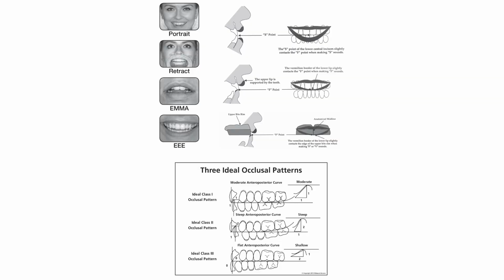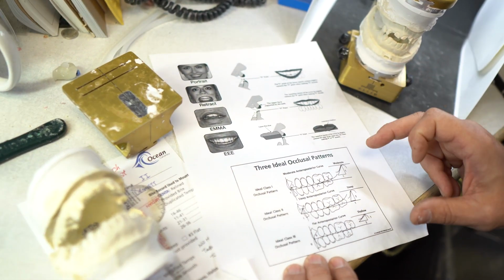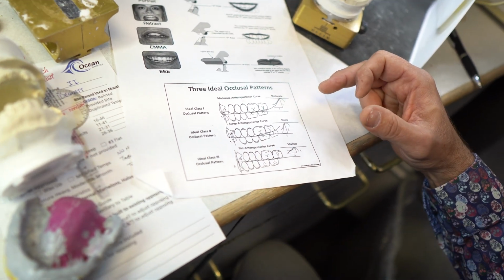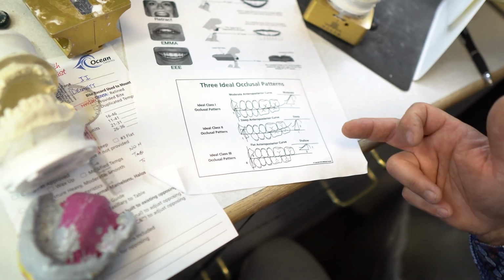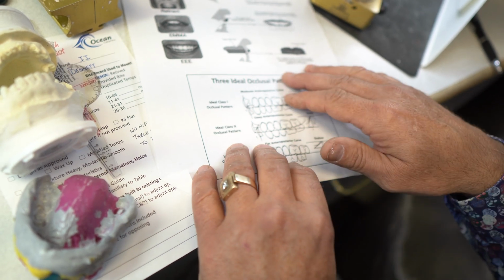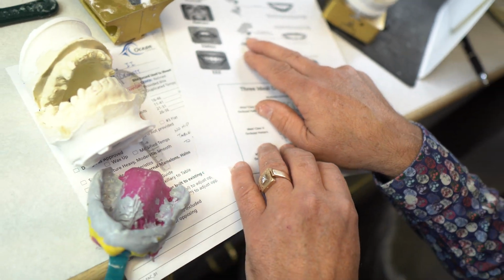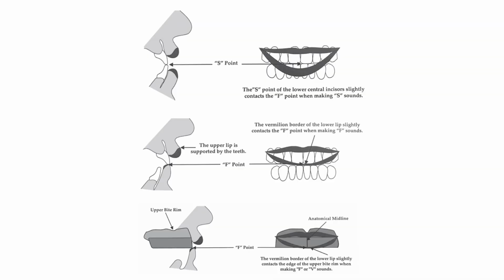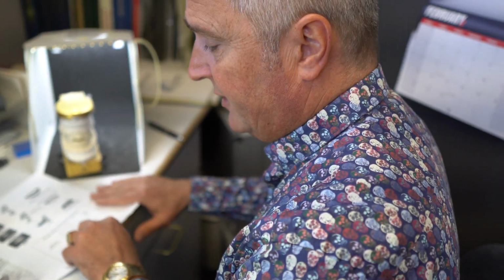So it's very, very important to really assess these things, and that's why we made this little cheat sheet for you to give us the right information. We need the pictures. It's nice to have. We realize you can't always get it, but if we discuss and are at least aware of what we're looking for, either moderate, steep, or shallow, this will determine what kind of occlusion we set up. And then last but not least, that's how we determine with these pictures what is the best F point for this patient. Okay, so that's what I just wanted to go over with this illustration.